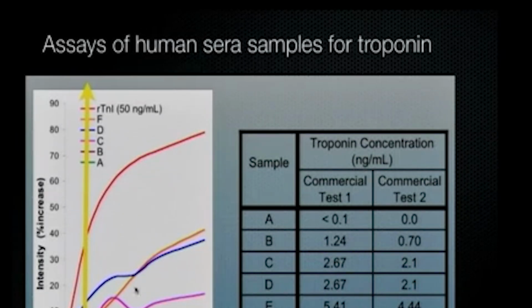That's right. So imagine that this is a marker for cardiovascular disease, a marker for stroke, then you can know within a few minutes that it's there or not.